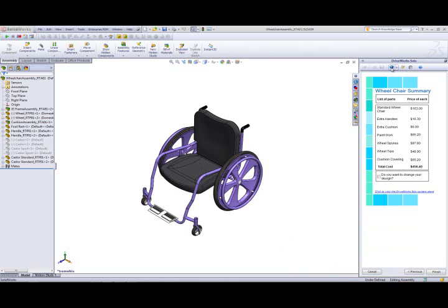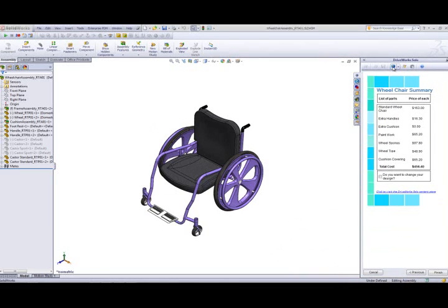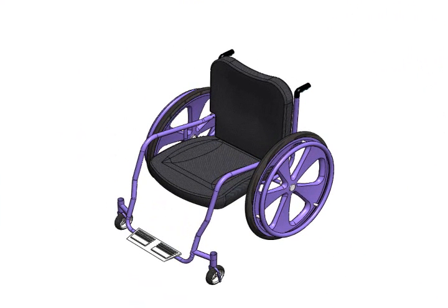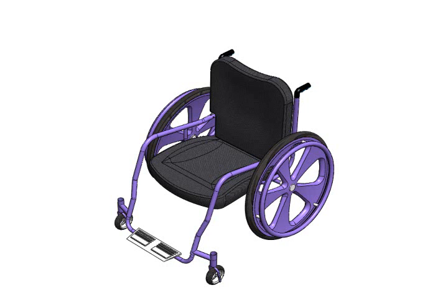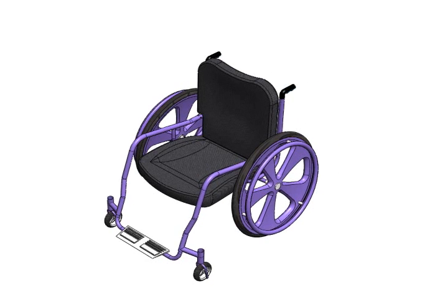Our wheelchair is now complete. We can now see the selections we made on the model. The frame color is purple, the amount of spokes that we have specified has been driven, the gray cotton seat has been applied, and there is no back cushion.